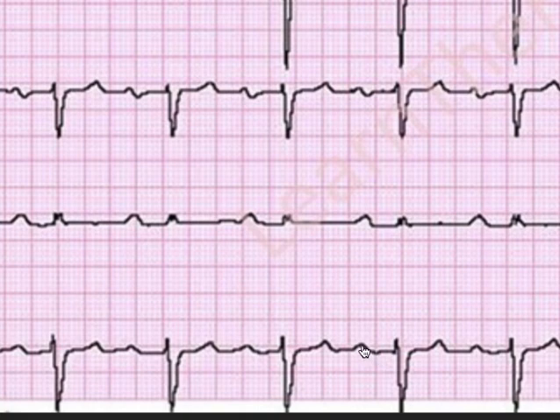Now, each P wave has a QRS complex, yes. P wave QRS, P wave QRS, P wave QRS. What is the PR interval? Now see, can you see how much the PR interval is? The PR interval is too much increased.